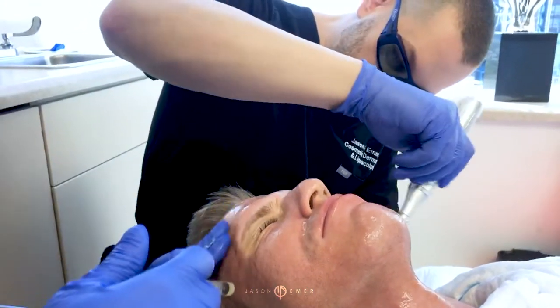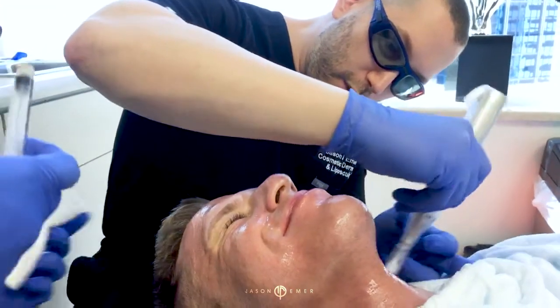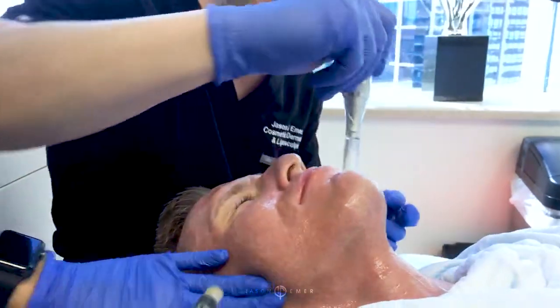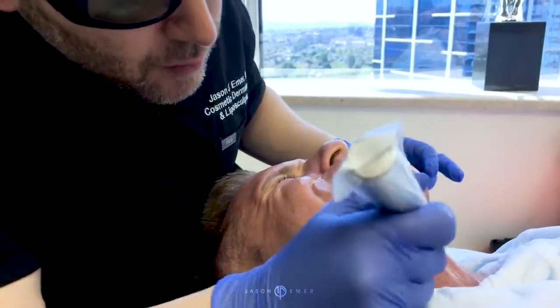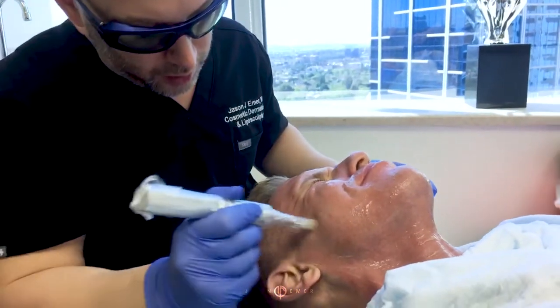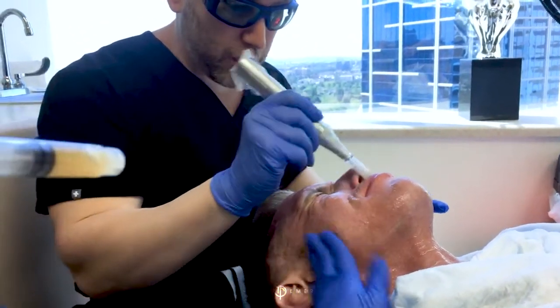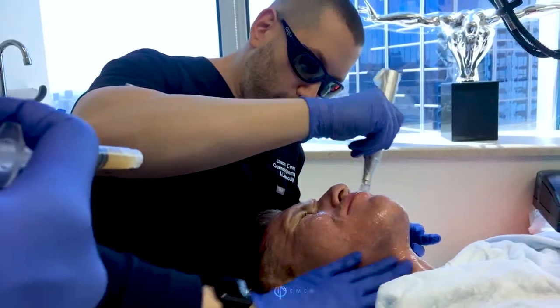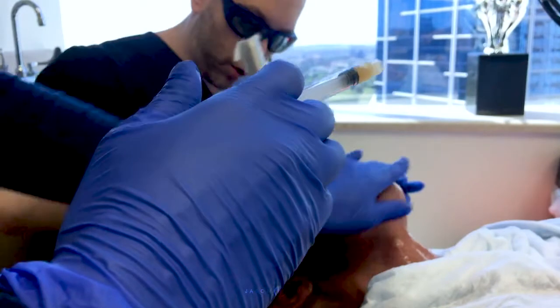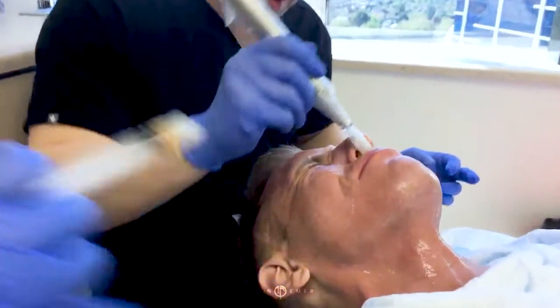It's fine. If it gets in the hairline, it's okay because it helps hair. That's what I always tell people. And we're just getting enough to push this into the skin. What would the stem cells do? The stem cells are mainly for healing purposes, but also to not only enhance the outcome, stimulate collagen production, but help prevention of skin cancers. So we're pushing that into the skin right now. And this is adipose derived. We also like bone marrow derived stem cells as well.